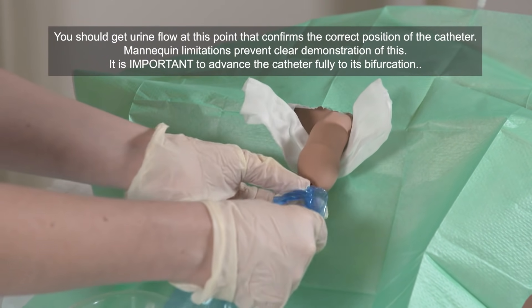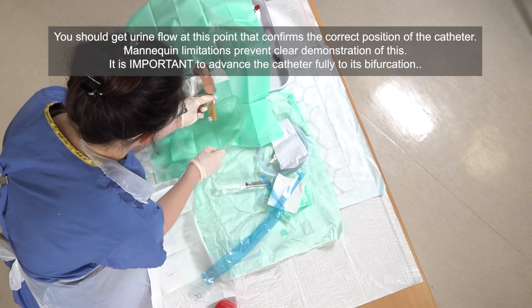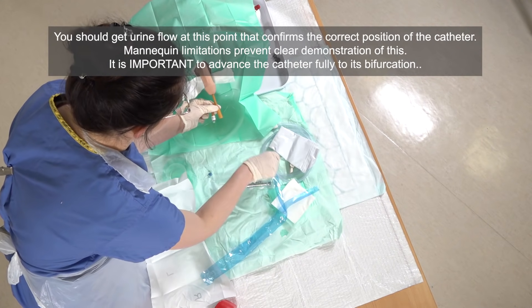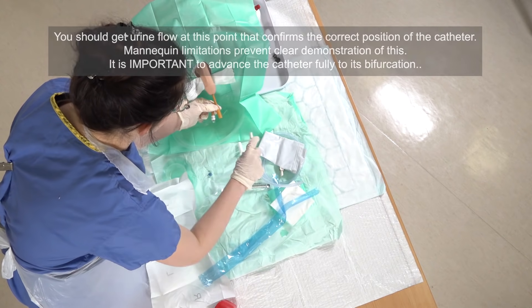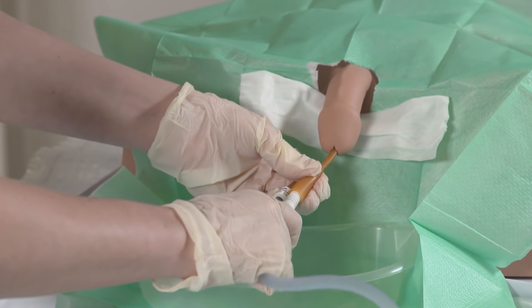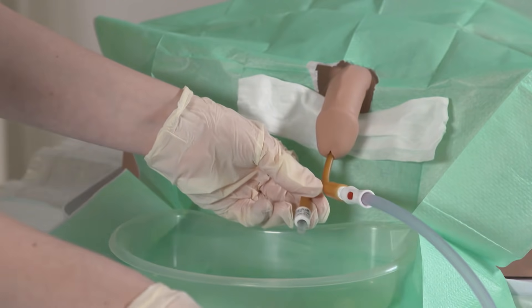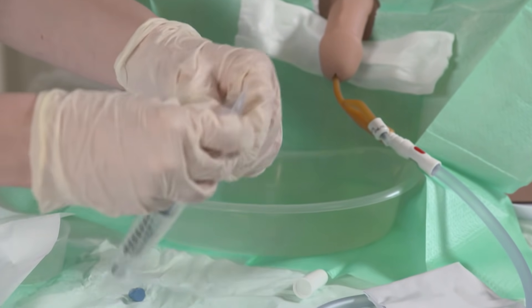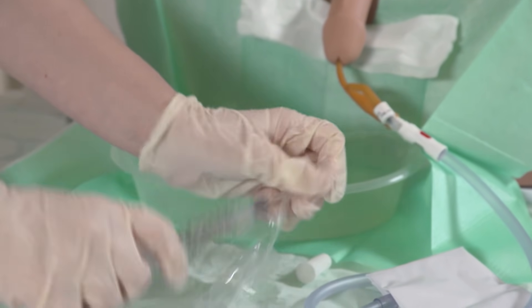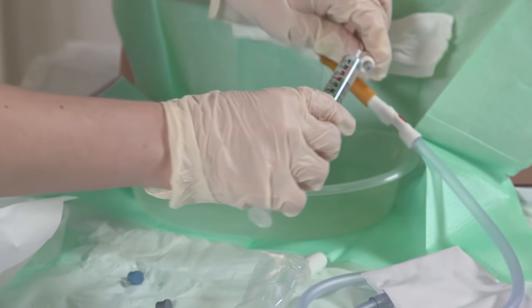Then we'll remove this plastic. At this point the urine should be coming out; if it isn't, it may just mean the patient needs to be repositioned. We can place the bag onto the end of the catheter, then using our other syringe of water, just inflate the balloon on this port.